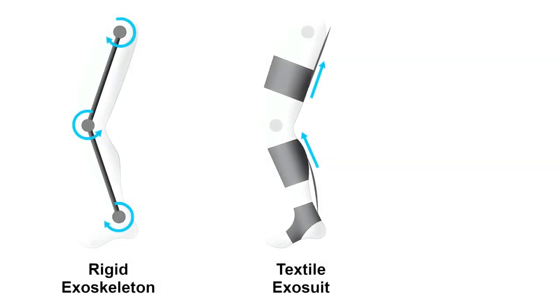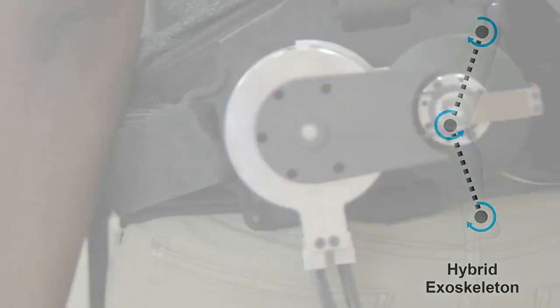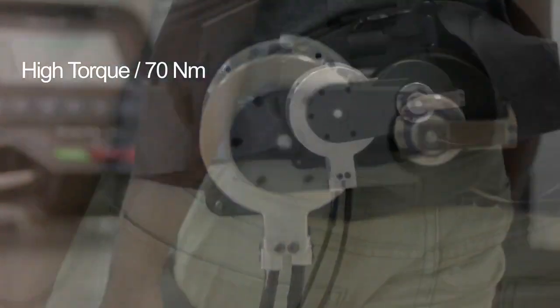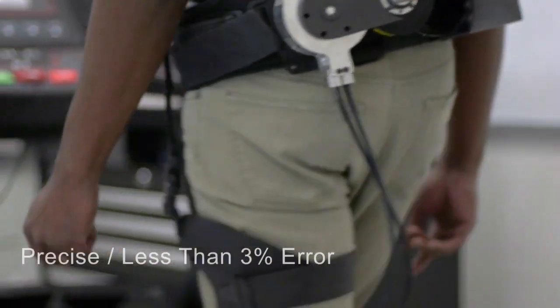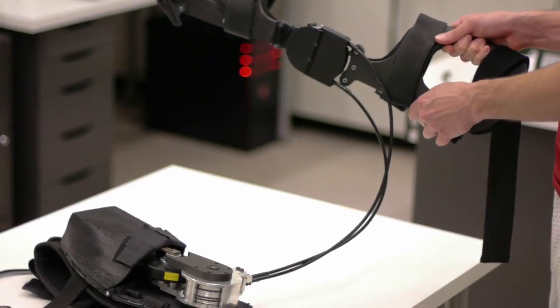Our robot combines the advantages of rigid exoskeletons and soft exoskeletons. Motors deliver power through soft cables to wearable structures to assist both flexion and extension motion.